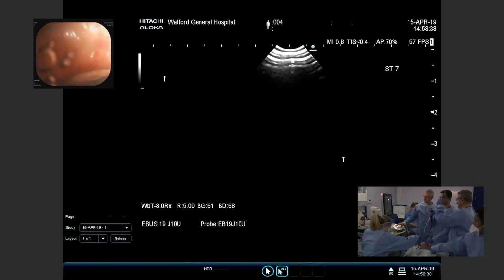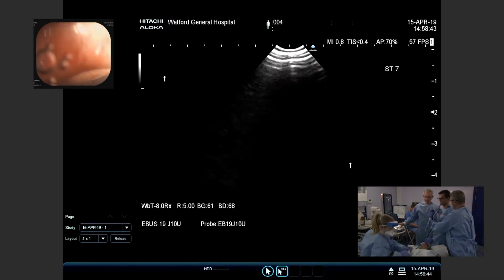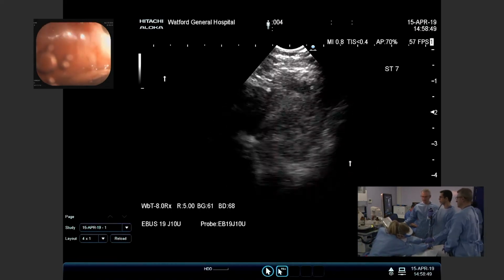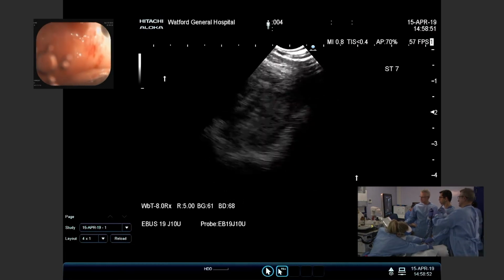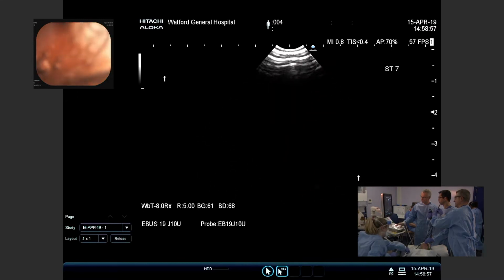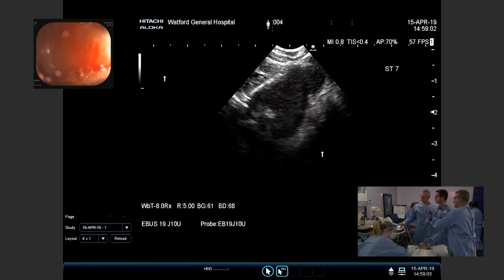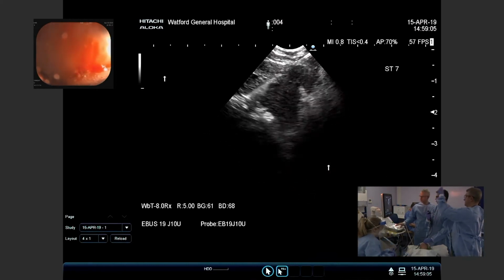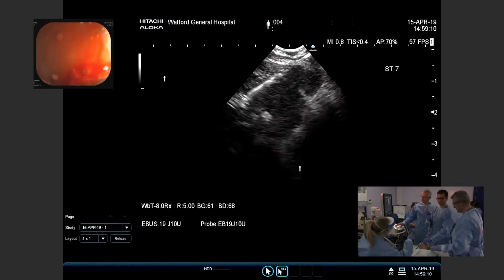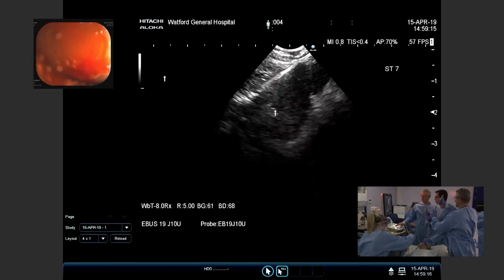But the ultrasound specialists are always available to help optimize the image when you commission a new service in the endoscopy unit. What's interesting is that there are some things the endoscopist can do also to minimize this. For example, getting a better apposition of the image. You can see the artifact is still there, but we have much better views and it's much less distracting.